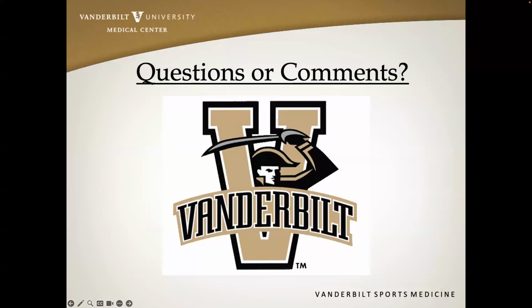Another thing to highlight, as you had mentioned, is that for any type of knee condition, it's important to include that suprapatellar recess view, just to look for any type of effusion. It's a very quick screen, because sometimes on clinical exam you may be questioning whether they have any fluid. And it's so easy to just put the ultrasound on that area to actually confirm whether they do have an intra-articular effusion or not. That can then clue you in more if you are concerned about an intra-articular structure, which may push you to get additional, more advanced imaging, such as an MRI.